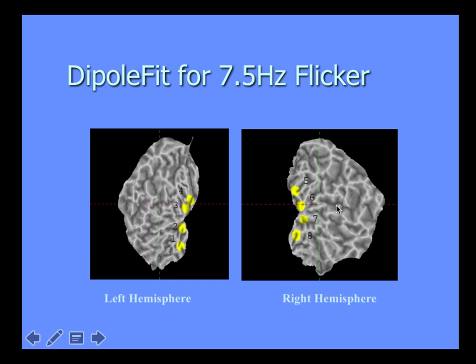We take the 8 octants, and this is an exploded view of the cortical mantle from the left and right occipital pole. These are the 8 octant locations. A visual psychophysiologist will tell you that's exactly where you would expect the primary visual cortex to be retinally, in terms of retinotopic mapping onto the brain. This is what I mean by millimeter resolution. Those spots are only a couple of millimeters apart, and we can separate those 8 octants. But again, we've given up time resolution to get that spatial resolution.